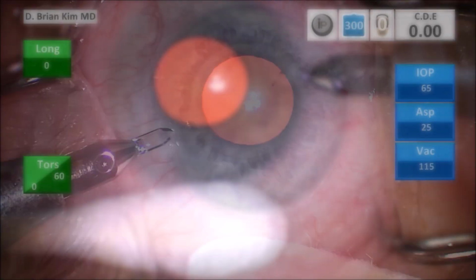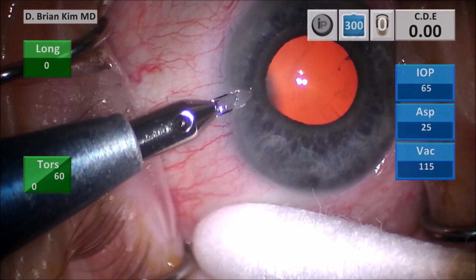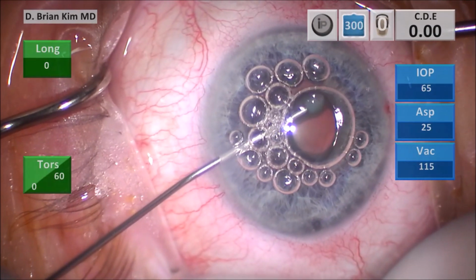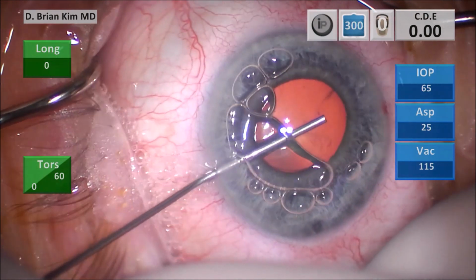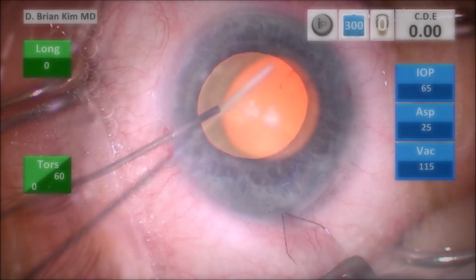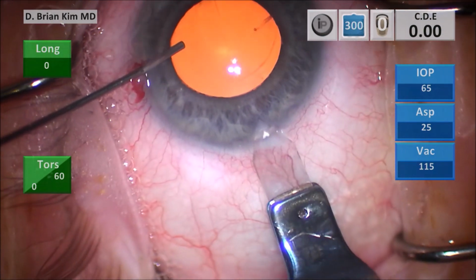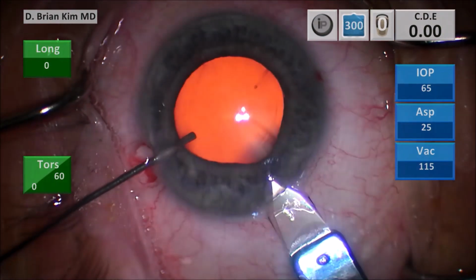I make my paracenteses on each side. I'm injecting intracameral lidocaine and epinephrine to see if I can dilate the pupil. And then I'm injecting dispersive viscoelastic. The pupil is getting a little bit bigger. I keep my cannula in the eye, and then I make my triplanar corneal incision. I make a vertical groove in the tunnel and then enter the anterior chamber.